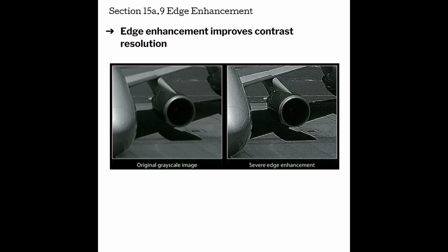In this example here, we have a very smooth looking image of a plane engine. With the contrast, if you look very carefully, anywhere that there's an interface, there's a kind of white or a highlight and then a low light on the other side. And because of that then, what we end up getting appear to be very, very sharp edges. So edge enhancement can improve the visualization of those borders because the machine recognizes where boundaries are and aims to enhance them.